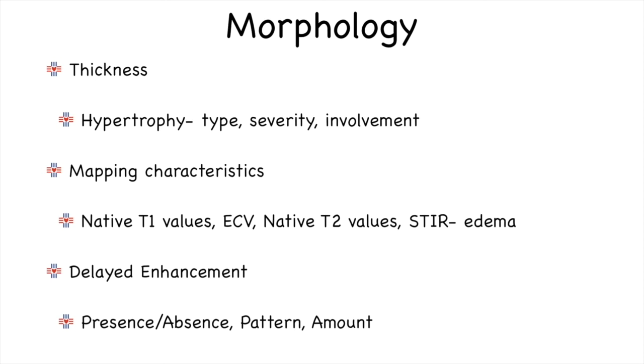We also talk about edema, whether focal areas or diffuse areas of myocardial edema are present. Delayed enhancement should also be commented on, based on whether it is present or absent, whether it's an ischemic pattern or non-ischemic pattern, and what is the percentage of fibrosis when available.